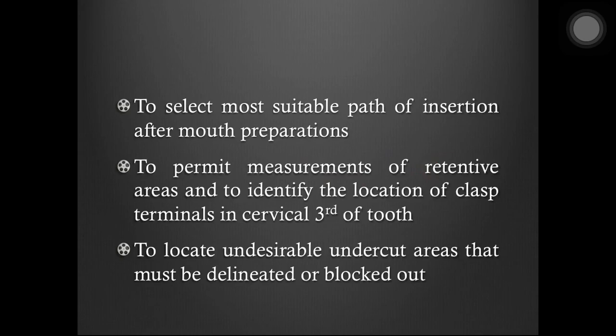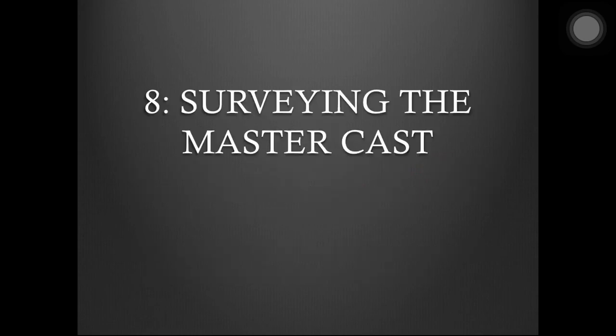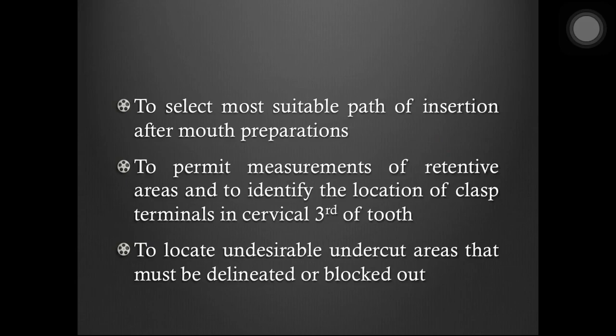This master cast is also then surveyed with the help of a surveyor, and there are different purposes of that too. Some of these purposes are the same as that of the surveying of the diagnostic cast, which is to select the most suitable path of insertion after mouth preparations, to permit measurements of retentive areas, and to identify the location of clasp terminals in the cervical third of the tooth.